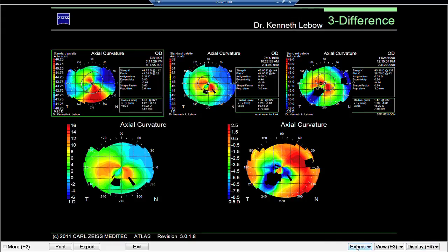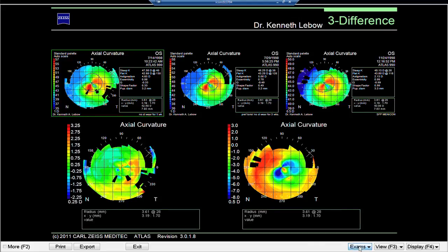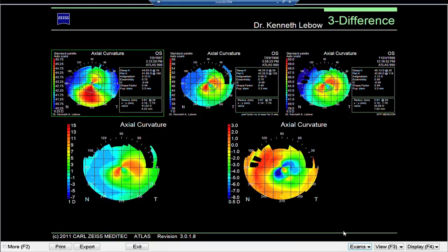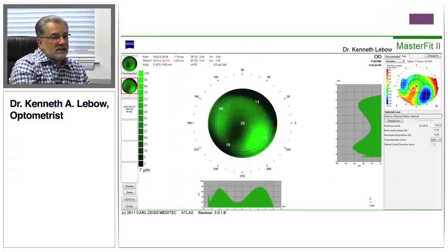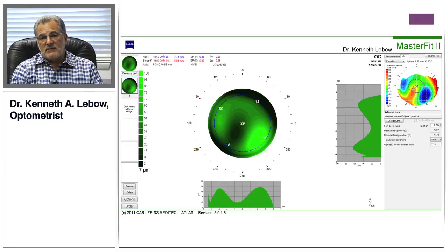Switching eyes: here's the development of keratoconus again — the original map upper left, then the development of keratoconus after using Muro Drops, which got rid of the swelling but not the keratoconus. Here's a very clear keratoconic pattern. Number three: we fit the rigid lens, and you can see the flattening associated with the contact lens. That's how I would utilize corneal topography in this much more complicated situation — a patient who started with soft toric lenses and then developed keratoconus.